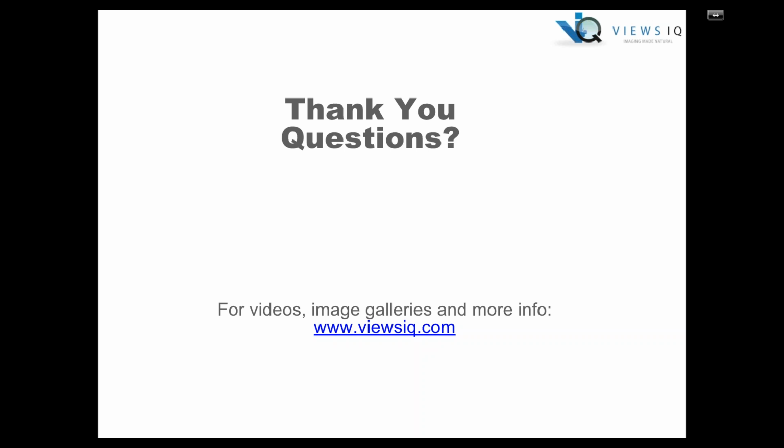Okay, so one of the questions is, what are the minimum specifications? That's a great question. I mentioned that Panoptic could be run from your own personal computer with minimum specs. In order to run the software, the computer just has to have a quad-core CPU, 8 gigabytes of RAM, we recommend, one USB 3 port, and it must run Windows 7 or higher.